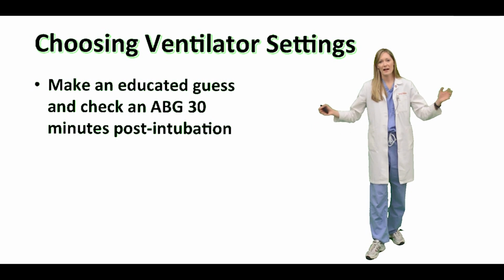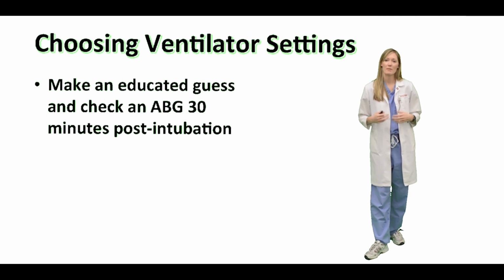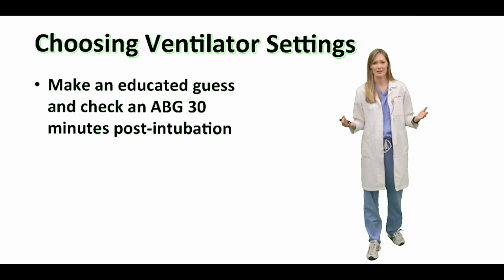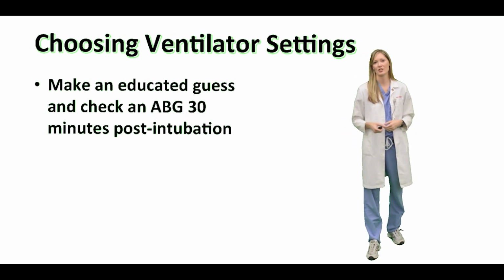So all of that combined, you're going to use your basic settings to begin with, and then some of these specific hints to try to make an educated guess about what the appropriate settings are, but I don't expect you to get it right every time. So check an ABG after 30 minutes, and then make further adjustments from there.